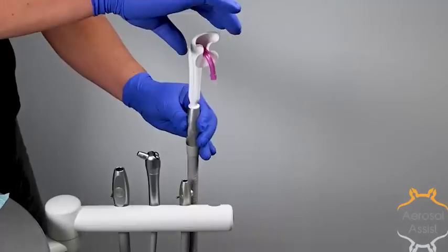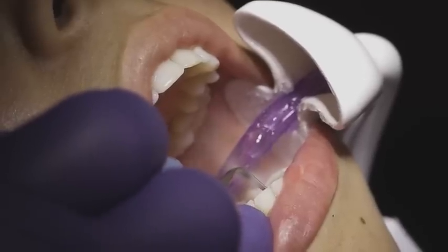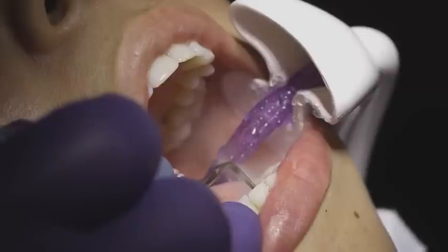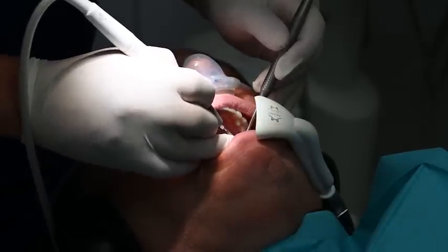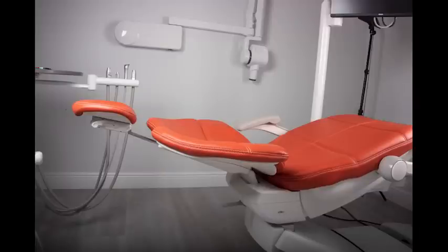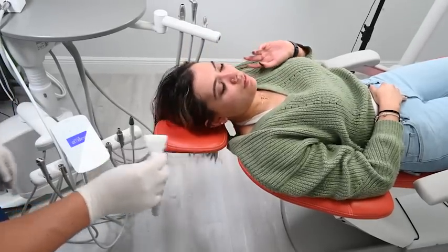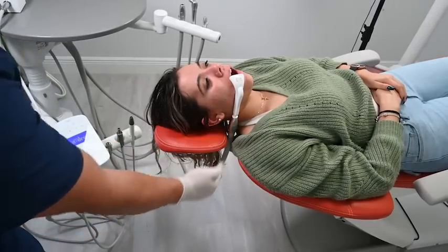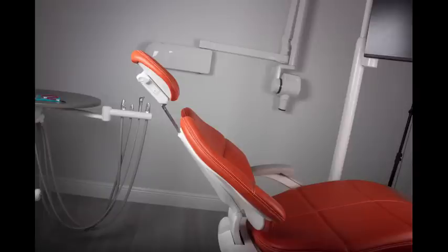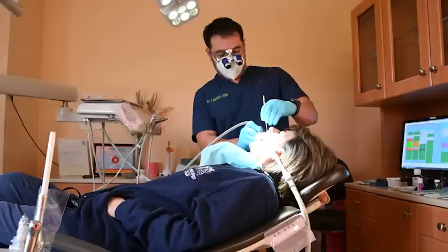The aerosol assist is designed to allow for easy rotation while remaining fixed on the HVE. We recommend positioning the aerosol assist on a dental team member before using it on a patient to make sure positioning is correct and comfortable. When used properly, it should be very comfortable and most patients will not even realize you are using a new device. When sitting the patient, it is important to have them in a supine position and make sure there is sufficient room to allow the HVE hose to fall in between the headrest and the chair. The HVE hose should be perpendicular to the floor and patient. Sitting them at a 45-degree angle can be done, but you need to make sure there is enough slack in the HVE line to not cause any additional tension. It is not recommended to use the aerosol assist above a 45-degree position.